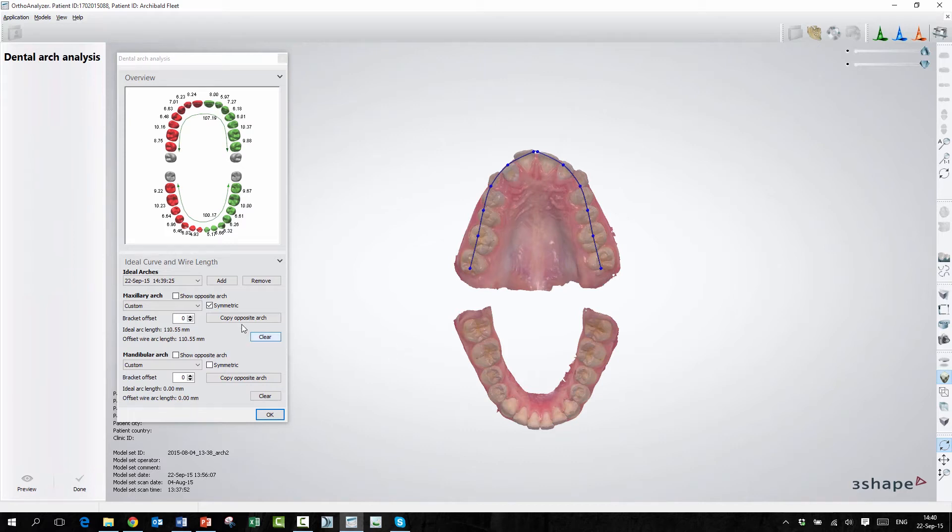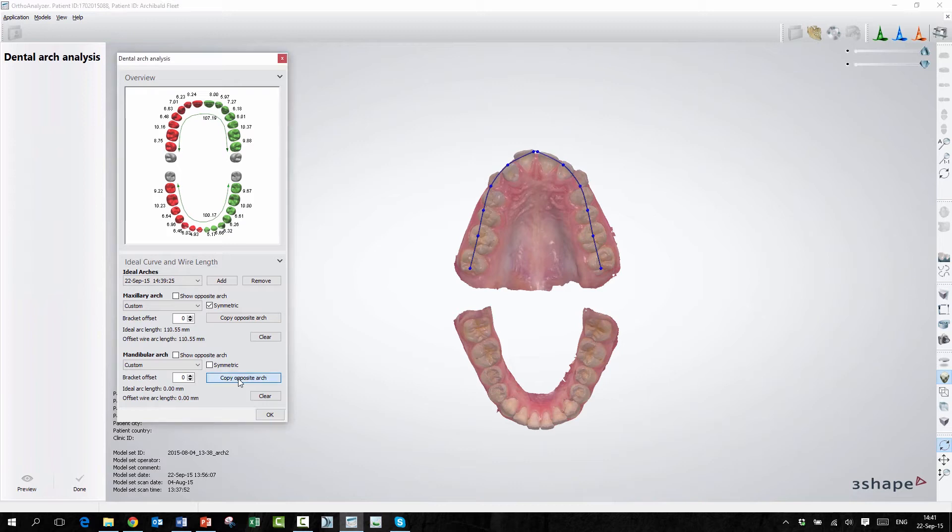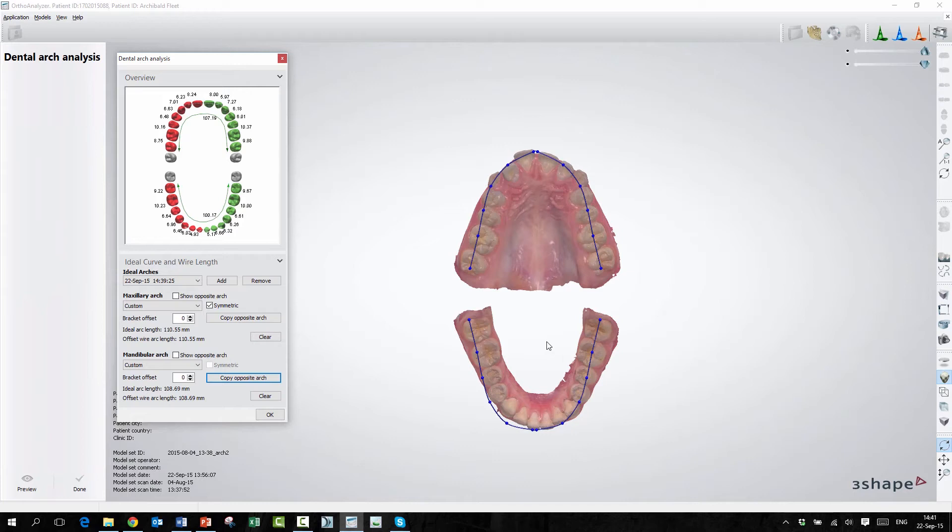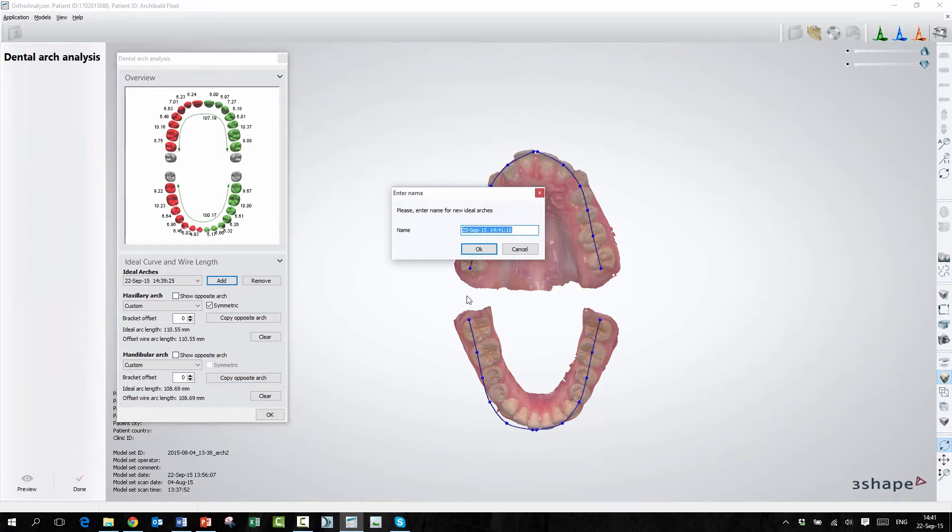Then we have Copy Opposite Arch. If I want to copy this arch to the lower jaw exactly the same, I can just press Copy Opposite Arch, and you can see that the arch will be copied down here. But this arch I've just made up by freehand. So if I want to use some guidance, I can make a new arch.